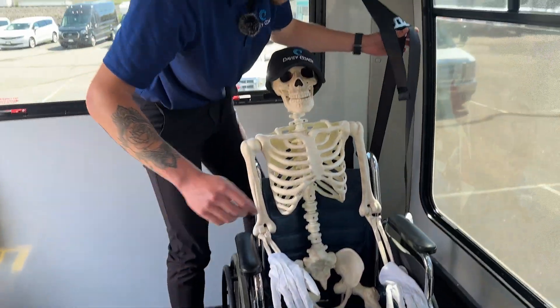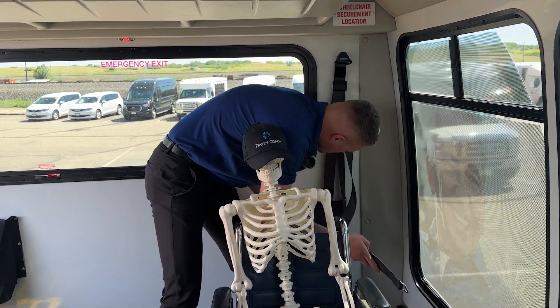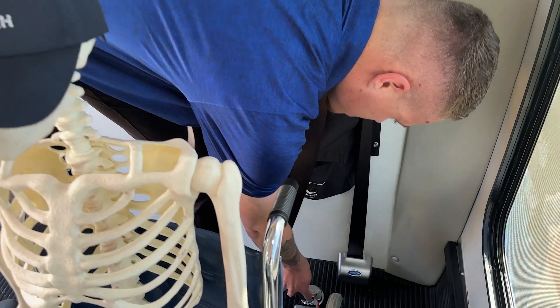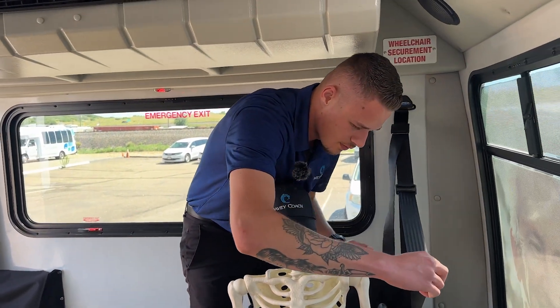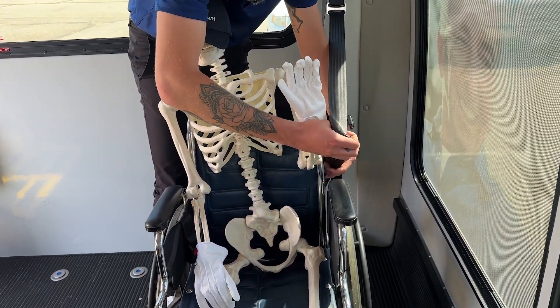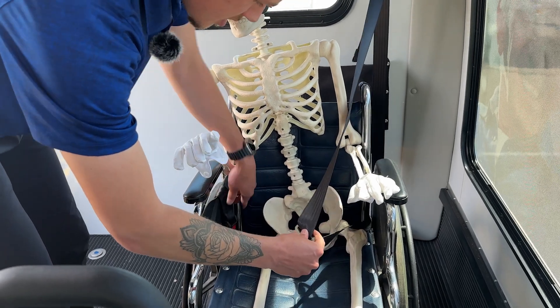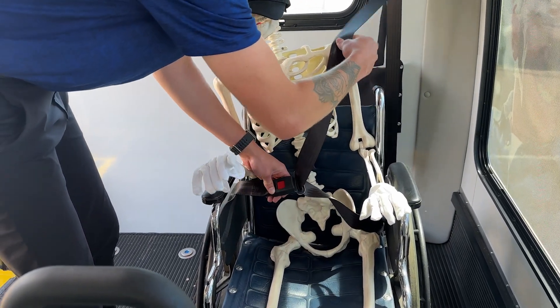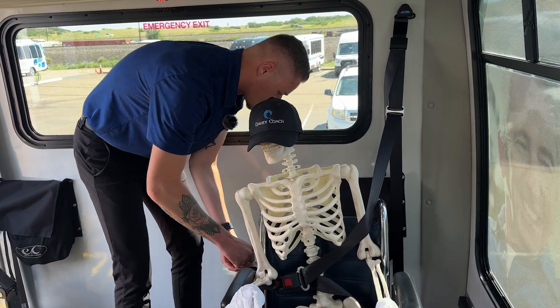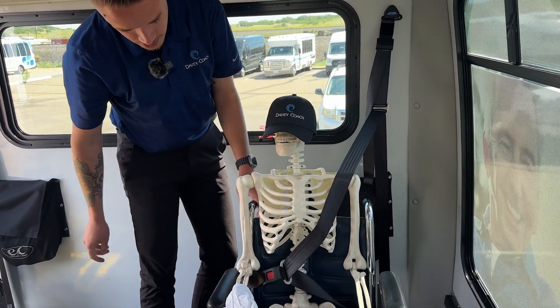Now we'll pull the shoulder strap over. On this shoulder harness there's the same tab that you attach to the left side securement point — make sure that's attached. Then pull the seatbelt itself over the passenger's shoulder, going between the armrests just like the last one, over the shoulder and around their waist. Attach the other side to the passenger, make sure the belt is nice and snug. There are extra long tongues on the belts — just pull on them. Same thing with the shoulder belt: pull and make sure it's nice and tight so the passenger won't move. And that's how you secure a wheelchair.